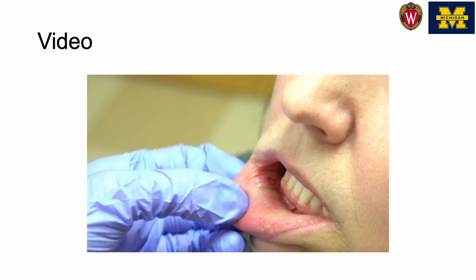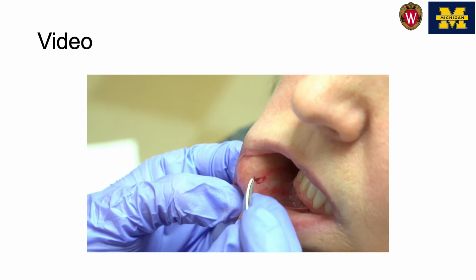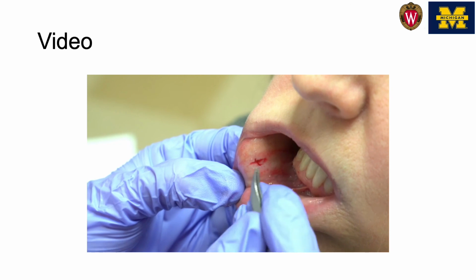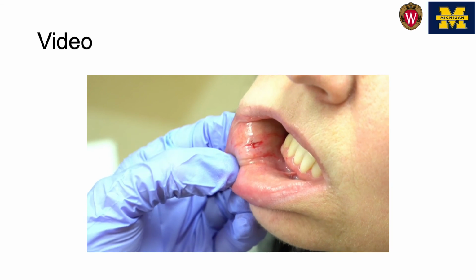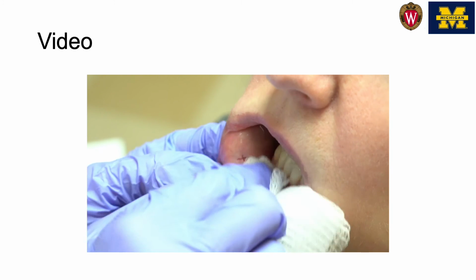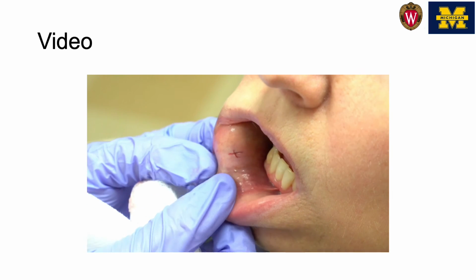And the next thing to do is to tuck the knot into the incision, burying the knot for the comfort of the patient and to avoid the discomfort of the knot rubbing on the gums before the suture dissolves.